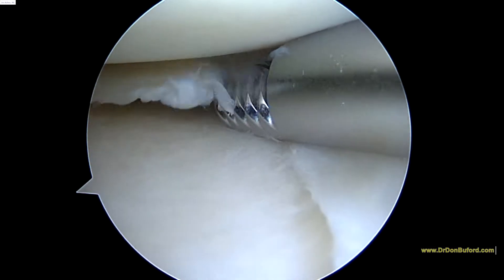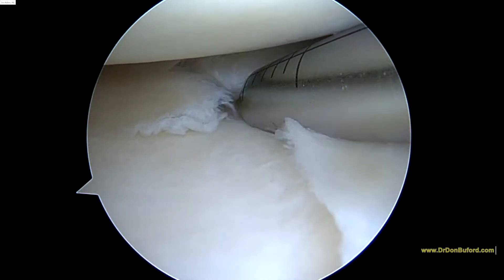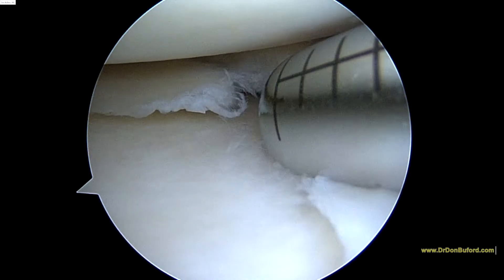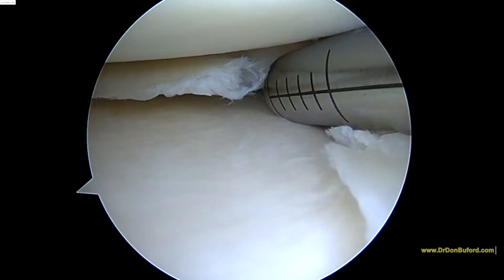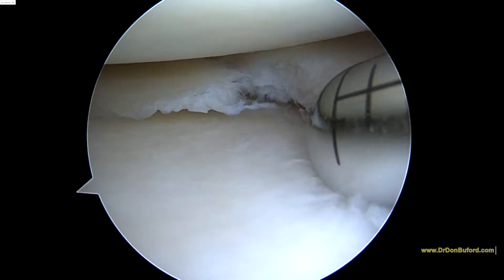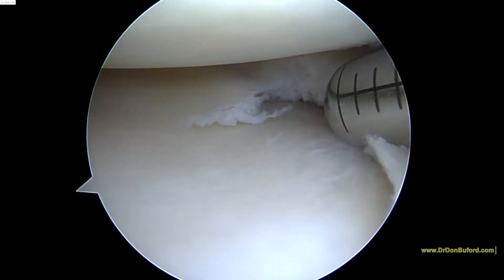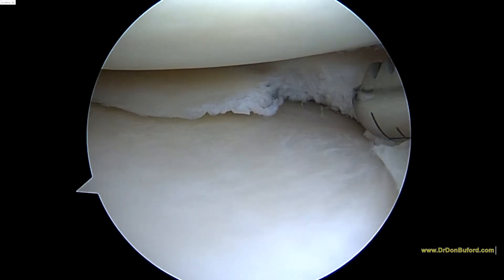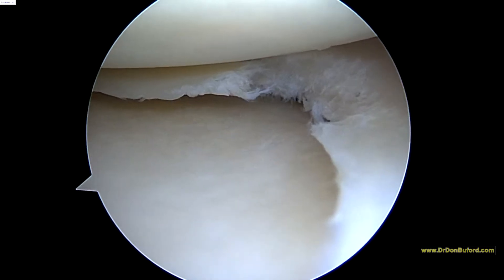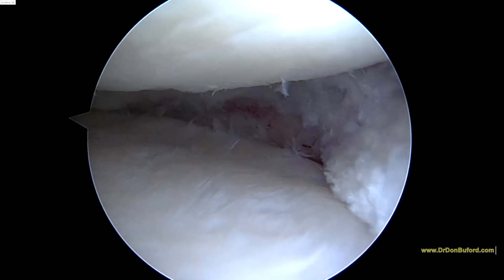So we're going to go ahead and start our shaver, just to smooth out the edges here. We're going to have to work on this portion right there. So we're all done addressing the meniscus — we've created a nice, smooth result, as you see here.